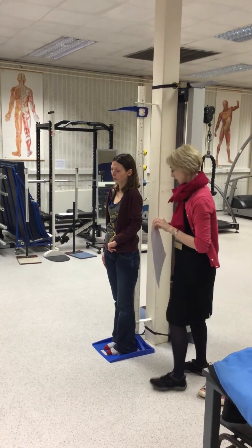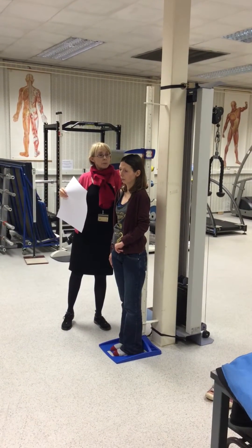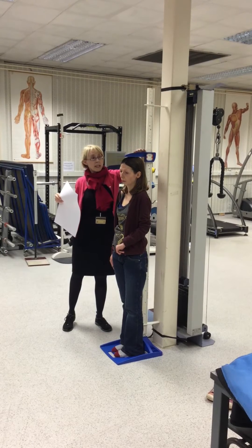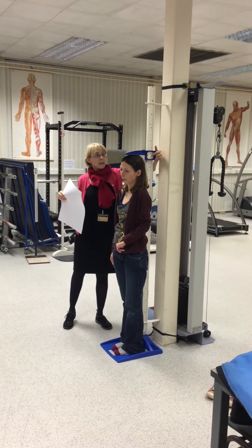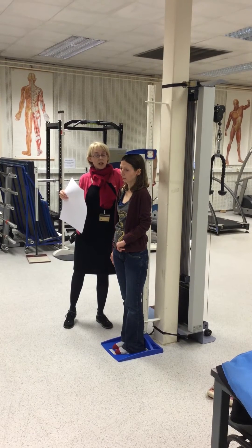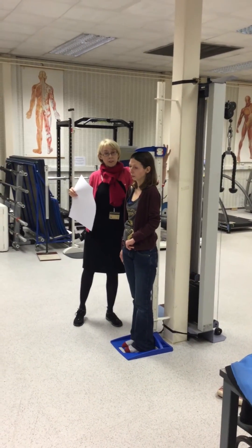So if you could just hold your head in that position, Lee, that would be great. Next thing is we just bring the level down to the top of the head. If you've got some curly hair, you might need to just push it down a little bit. Then you can measure from the side here, where the needle is, to measure the height. For this practical, we're wanting you to record the height in metres to two decimal places — so for now, it would be 1.59m.